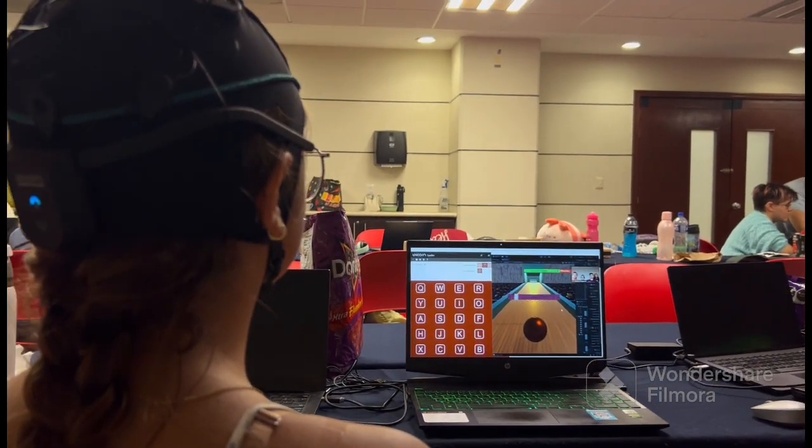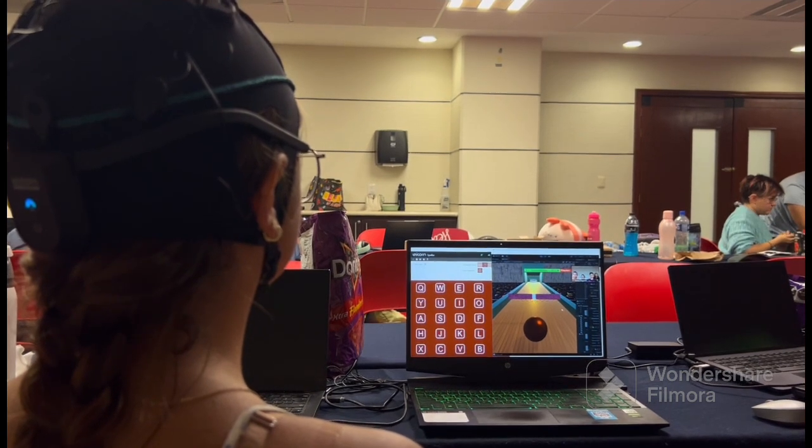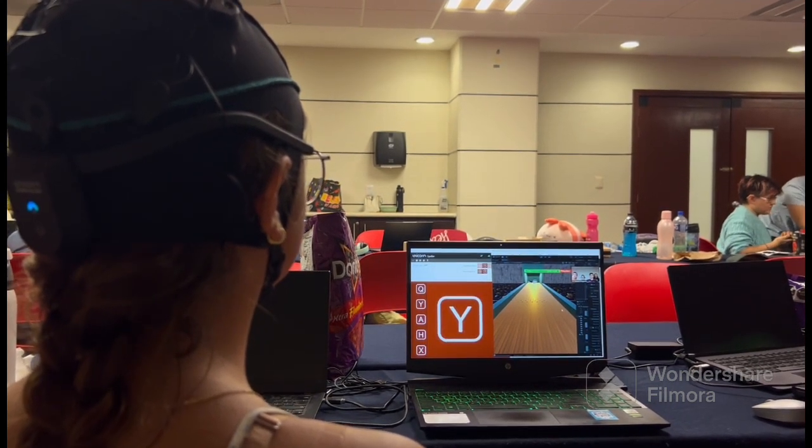Furthermore, it's important to note that to trigger the ball's motion again, Ana Laura must shift her focus to the letter Y, as defined by our coding.